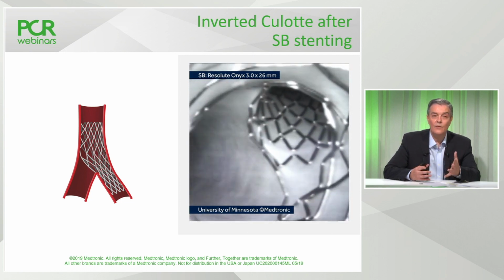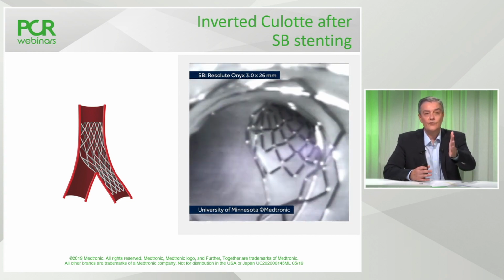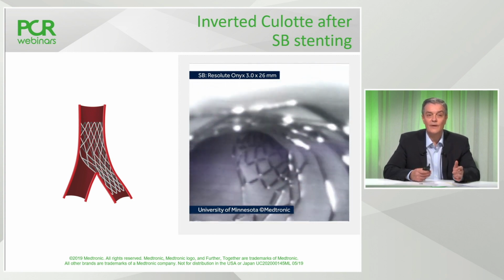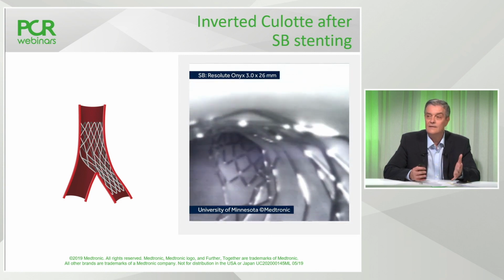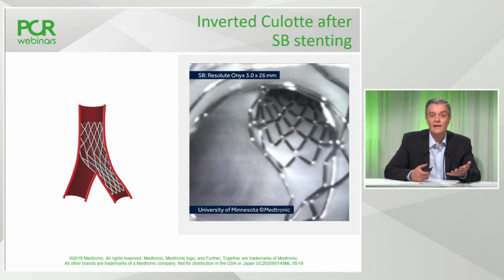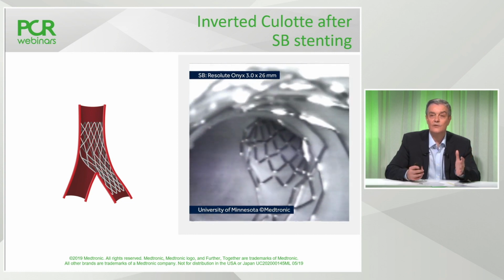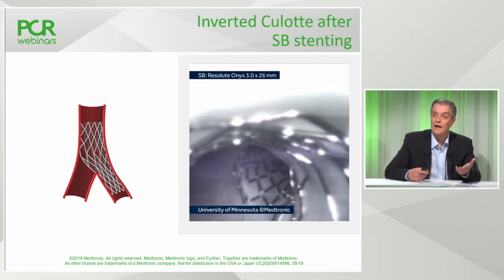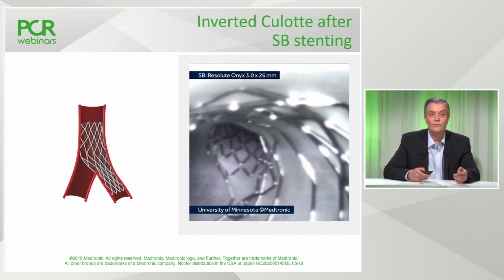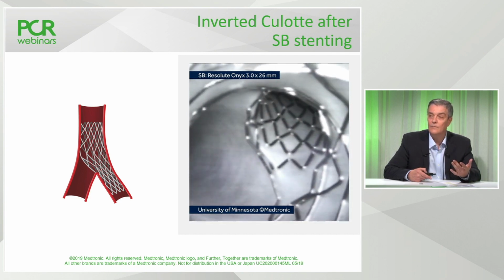And then after opening, after proximal optimization, kissing was actually performed. So you see on the left side a wide open access towards the distal part of the LAD, and this is actually the step where you select stenting. And for stenting, if you have such good opening, you can select stent size again according to distal LAD diameter. So you did that one. Maybe we go to the next slide and you describe how you selected what stent and what was the length of overlap.